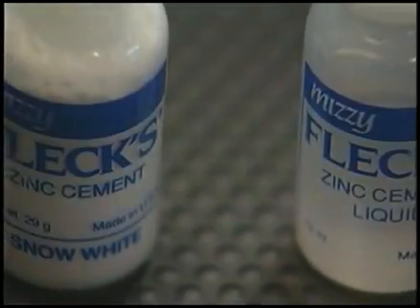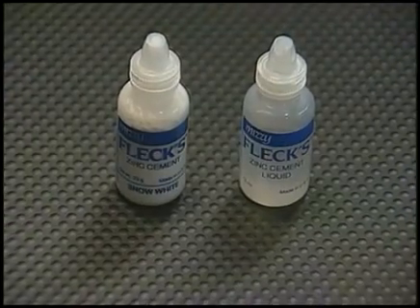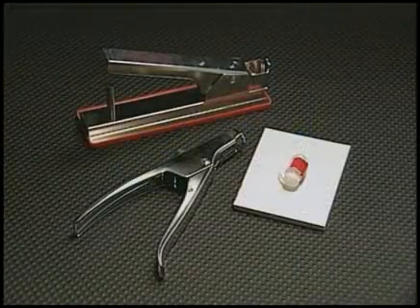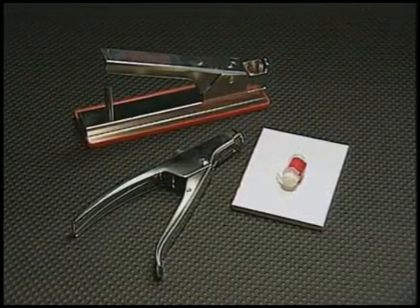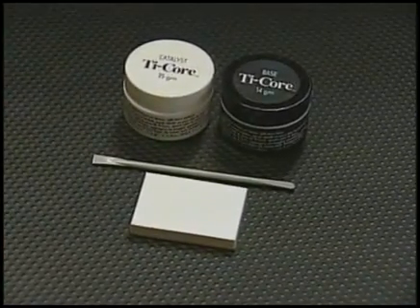Another factor that will influence safe and successful post retrieval is the cementing agent. Historically, posts were cemented with classic cements such as zinc phosphate, Durelon, or epoxies. However, with the emergence of new adhesive materials such as composite resins and glass ionomers, posts are frequently bonded into root canals, substantially increasing the difficulty for safe and successful removal.